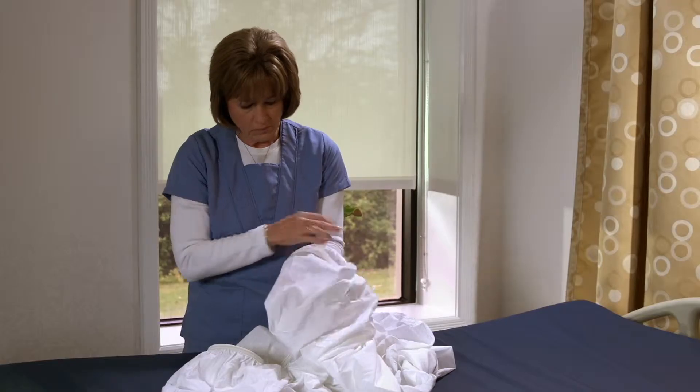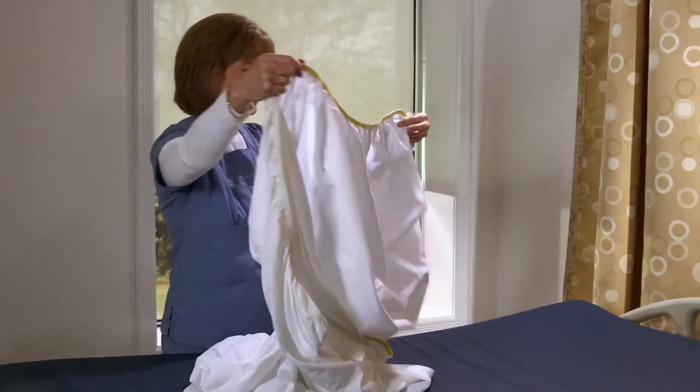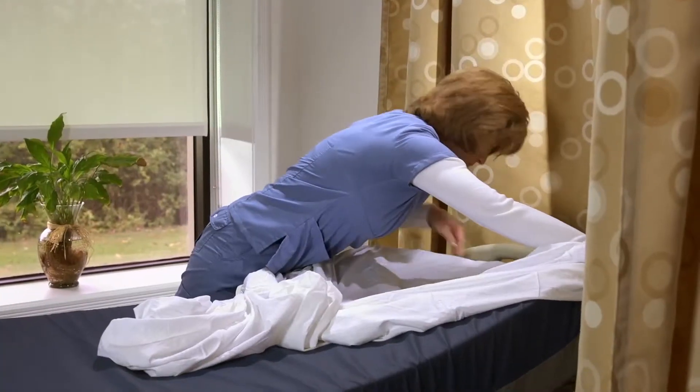Fitted sheet. The reinforced elastic and the extra deep pockets of the Dermatherapy fitted sheet were created to ensure a proper fit for mattresses of all sizes. Place the sheet on the bed so the stripes are horizontal with the end of the mattress.